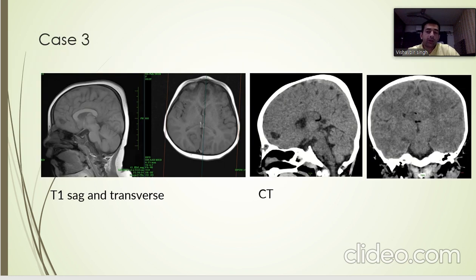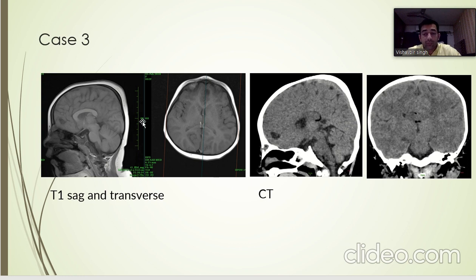Coming to Case 3, on T1 sagittal and transverse sections we can see a curvilinear lipoma in the posterior portion of the corpus callosum. We can also see another soft tissue density extending from a small bony defect which could be a meningoencephalocele. On CT, the region corresponds to a low CT attenuation value of fat.